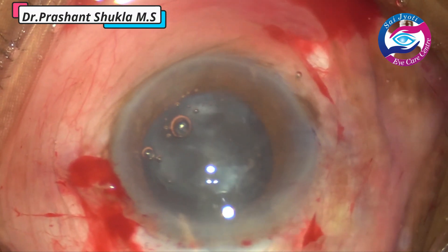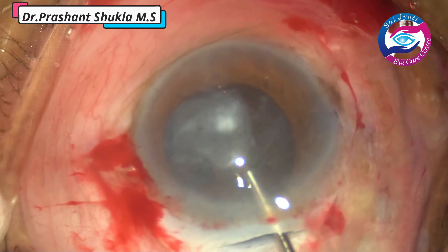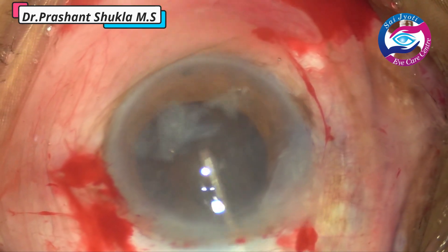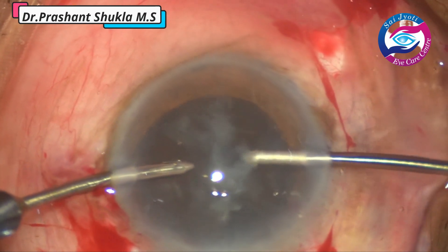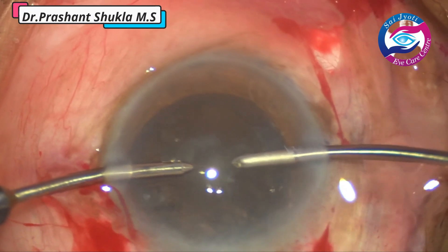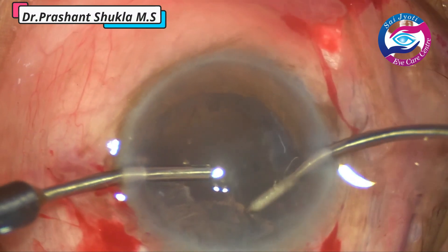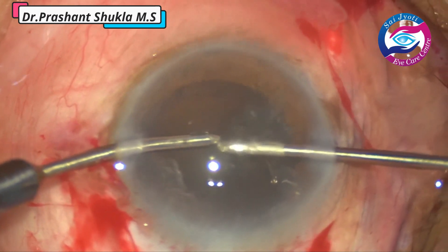Here again bi-manual irrigation aspiration is used to flush out all the cortex from the capsular bag and the anterior chamber. The probe is moved and the water jet is directed towards the epinucleus and the cortex to flush out whatever loose cortex is there. Then the aspiration handpiece is also used — vacuum is 300 and bottle height is 90. With proper foot control movements the cortex is held, pulled towards the centre, and then aspirated. We usually avoid aspiration of cortex at the periphery — first it is pulled into the centre safe zone and then aspirated.